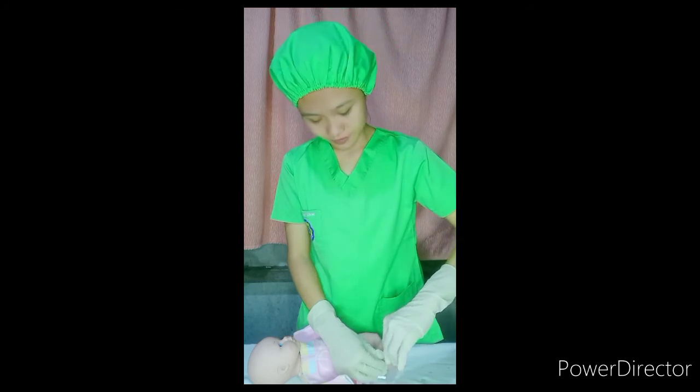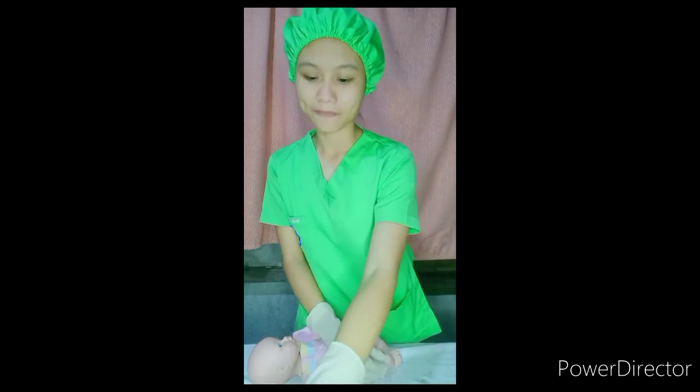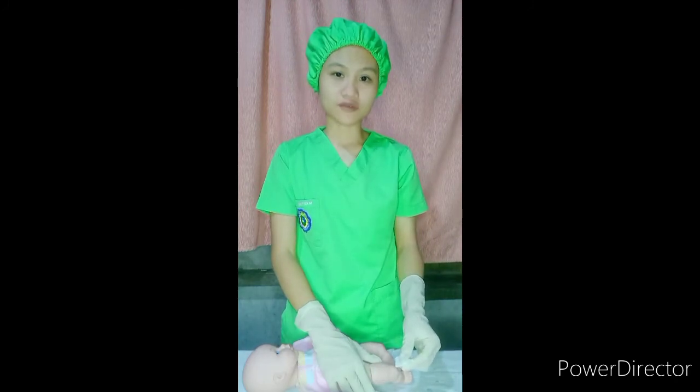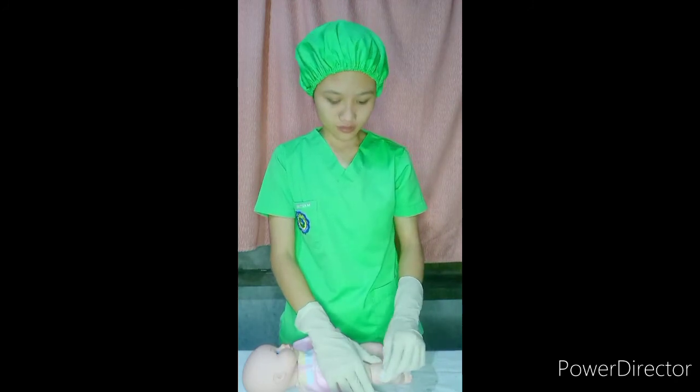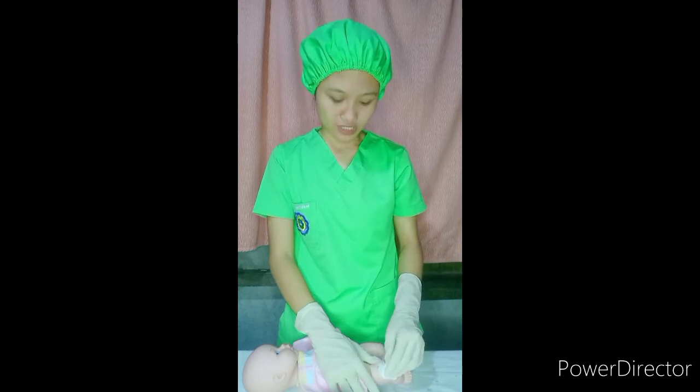Then withdraw the needle quickly at the same angle at which it was inserted while supporting the surrounding area with your non-dominant hand. Using a gauze square, apply gentle pressure on the site after the needle is withdrawn. Do not massage the site.